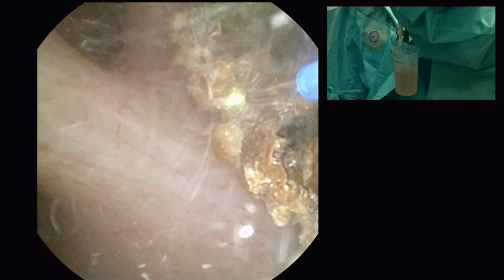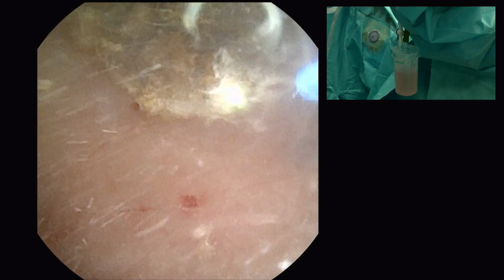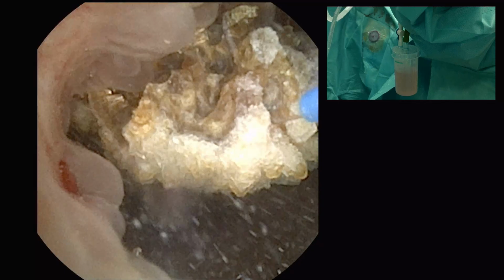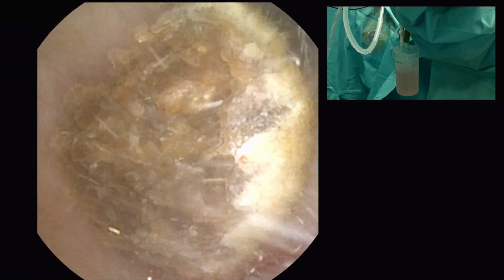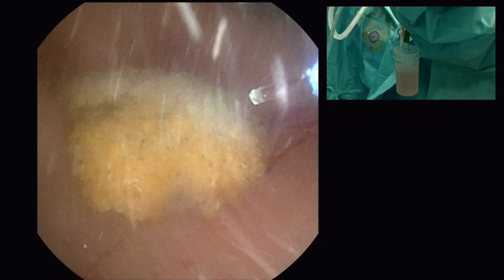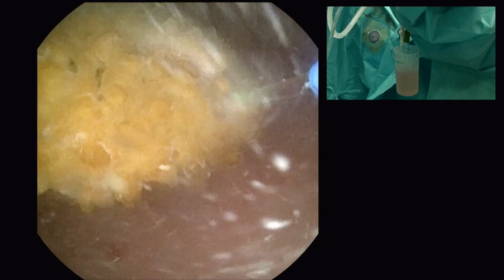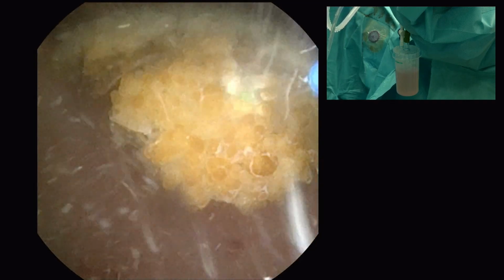A lot of movements. Any questions, I can answer. We can see the dusting going on very well, Dr. Sajad. In the end when you break the stone into fragments, they'll form many fragments. So I have turned it upside down, and now I will go from here again to make it thinner.